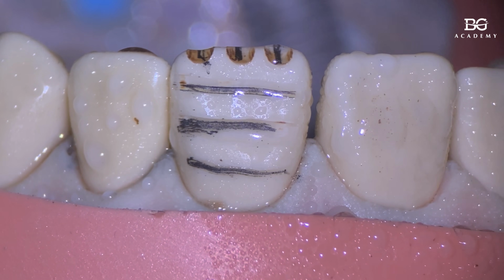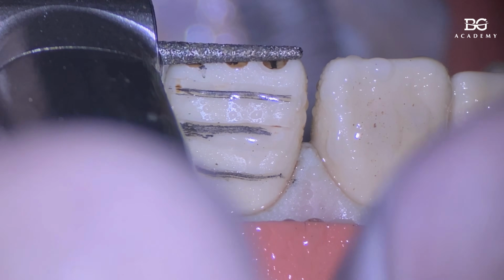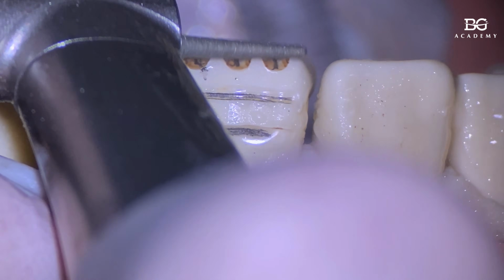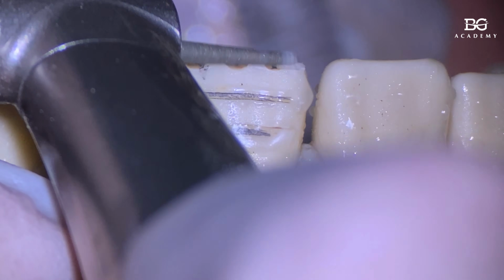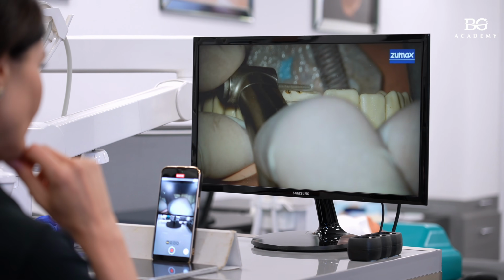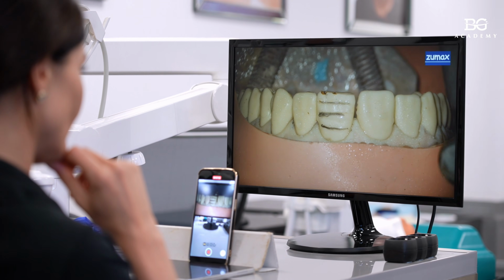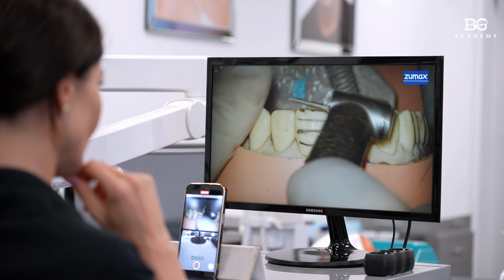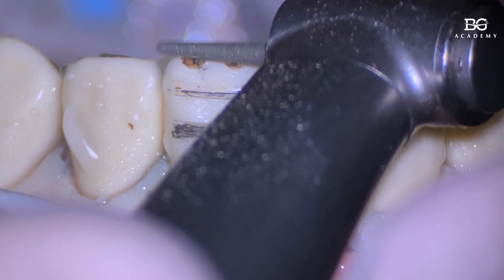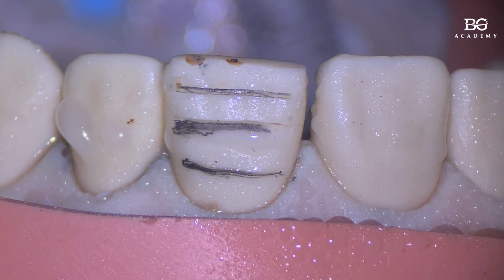The angle that I use to reduce the incisal edge can be like that. So this is one option. You place it almost horizontal. You cannot place it completely horizontal, because adjacent teeth will be in your way. But you can do a lot of prep with this angulation. Then you can turn your bur and do this part.